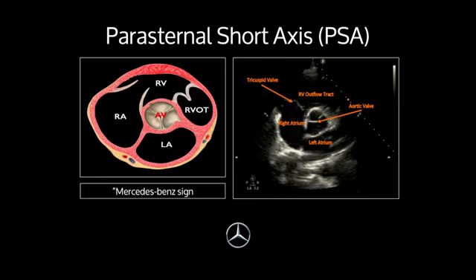Most anteriorly is the right ventricle with the RA feeding through the tricuspid valve. The tricuspid aortic valve is right in the middle. The left atrium is the deepest structure feeding down into the screen out of plane of the probe. The LA is the deepest structure.